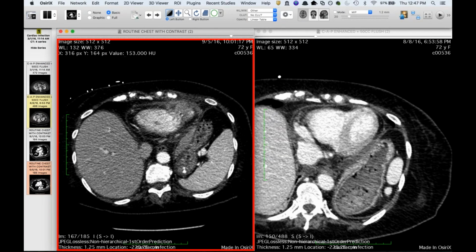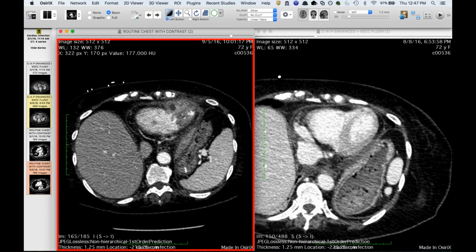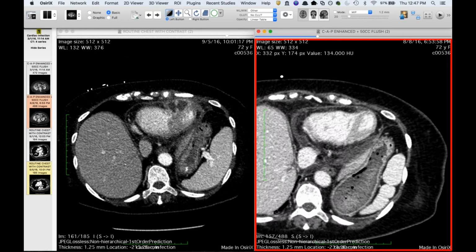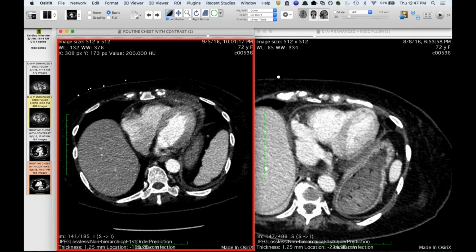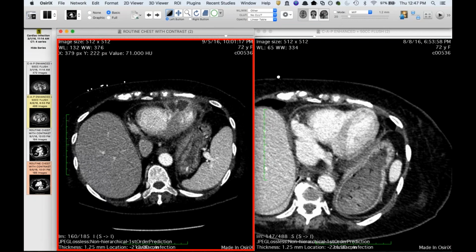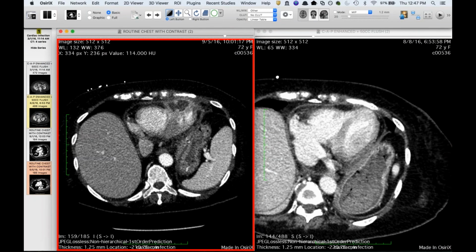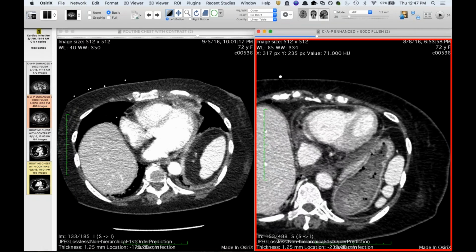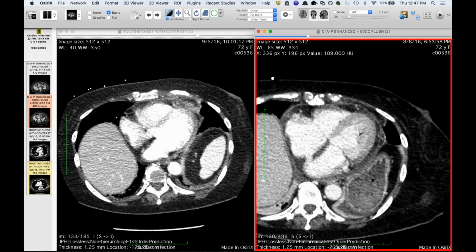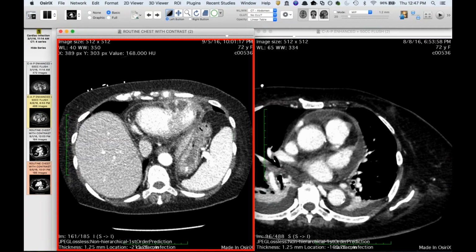Yeah, and then it's kind of interesting that you can see it's basically lifting her LAD up too, which is another reason I was wondering if we thought it probably started in the myocardium and then just extended into the epicardial space. So, but you're exactly right, David, that it's very loculated, and that's why we think it probably started in the myocardium. But I think at this point, it's a purulent myopericarditis, maybe would be a better term for it. Okay. But yeah, it's just a very interesting case, and also just subtle on this one. But unfortunately, we'll never get Path on it, and I don't think she's with us anymore.